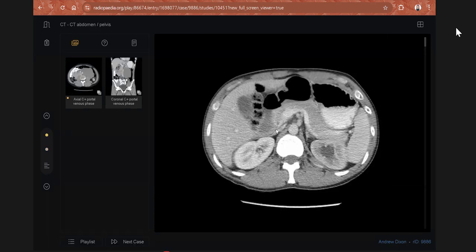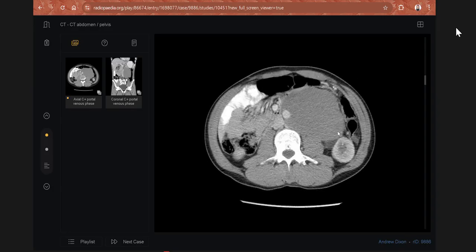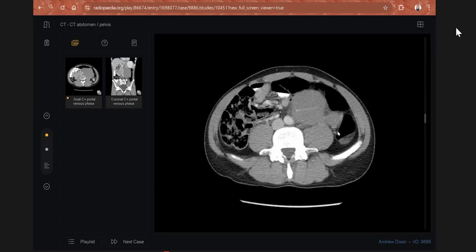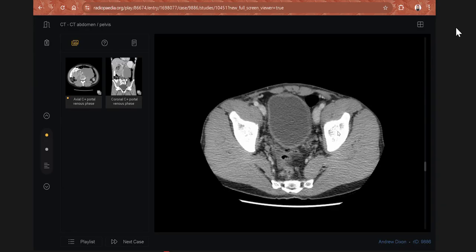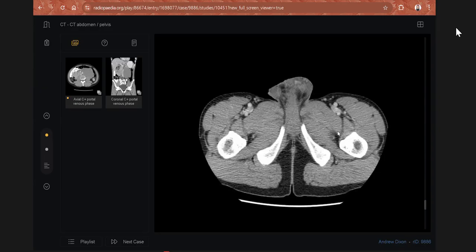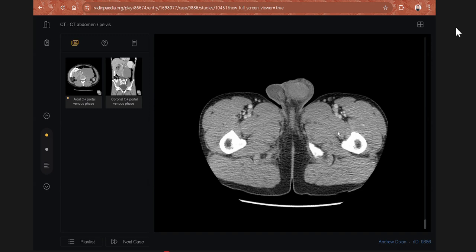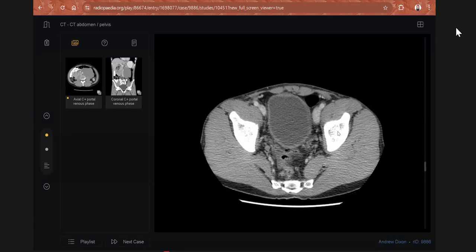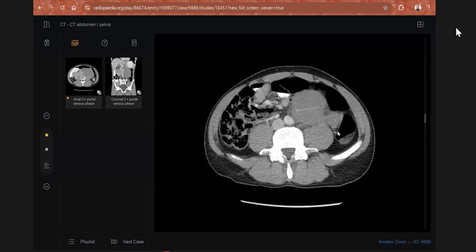Okay, CT abdomen and pelvis performed. Now you can proceed. So I've been presented with the CT abdomen and pelvis, in which I can see a large, most probably nodal mass that is noted on the left side of the abdomen in the retroperitoneum. That is a big amalgamated nodal mass. Considering the previous ultrasound examination and this nodal mass, and also an enhancing mass-like lesion in the left scrotum, the first probability is actually of malignancy with associated nodal masses in the para-aortic region.